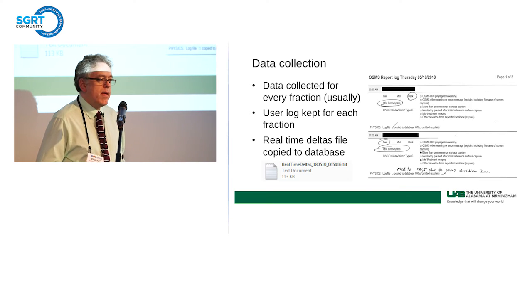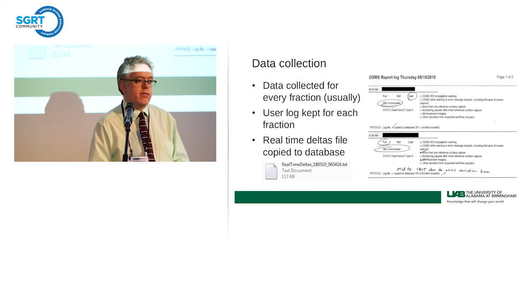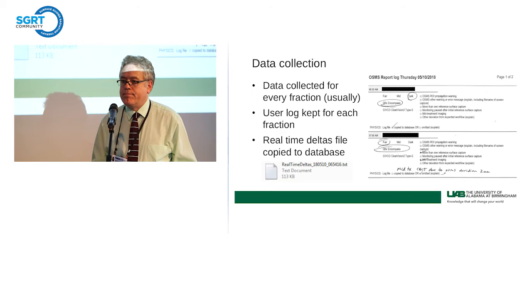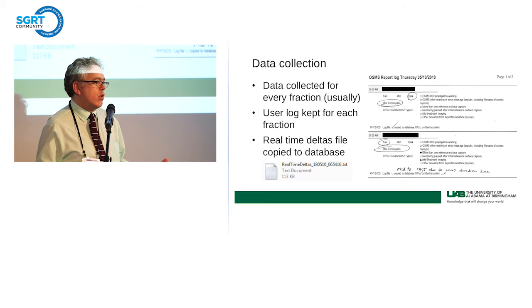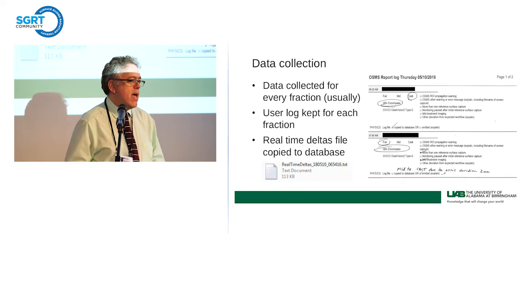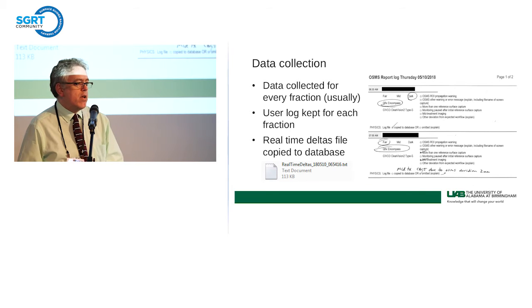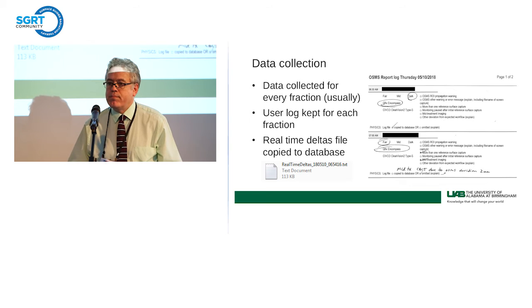So at UAB, we have a philosophy. We've implemented many clinical projects where over time we've gathered a lot of experience that we've wanted to share with the outside world, but we have no quantitative data. And so we go, well, we know all this, we've got all this data, we'll go back and get that data and show what we know to be anecdotally true. And we found that that's never a fun exercise and often never very rewarding. So we've learned to build data gathering into our clinical processes from their inception.